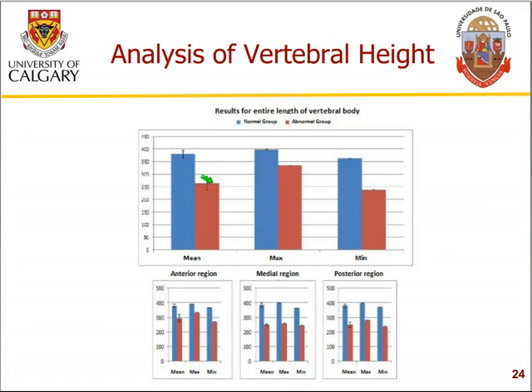There is some more work to be done to improve the segmentation of the plateaus. We have another procedure that Eduardo has developed in which the entire vertebral body is segmented and detected. We may be able to get better results by detecting the entire vertebral body and then detecting their edges rather than trying to detect the plateaus only. But we are still experimenting with a few different options.